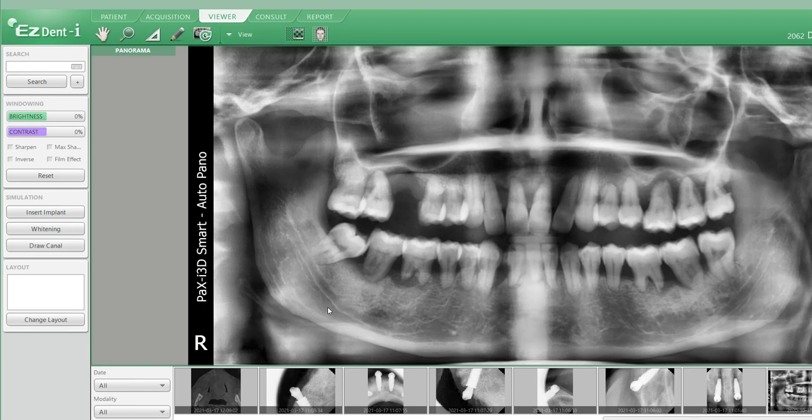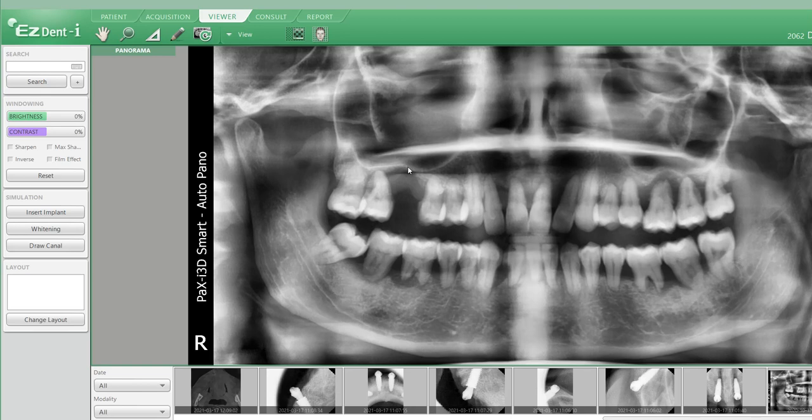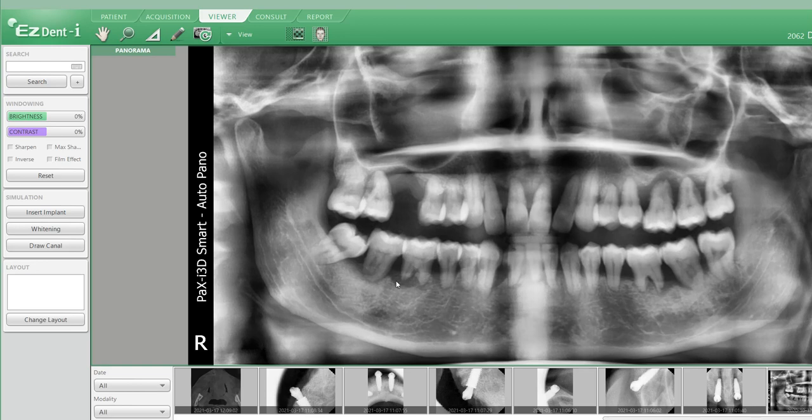When she first came in, she actually was seeking for an option to treat her periodontal disease. As you can see here, maybe not to the untrained eye, but Kaylin, what do you see here? The roots. She's got major root resorption. Massive bone loss. Massive bone loss and infection. Massive, massive bone loss.